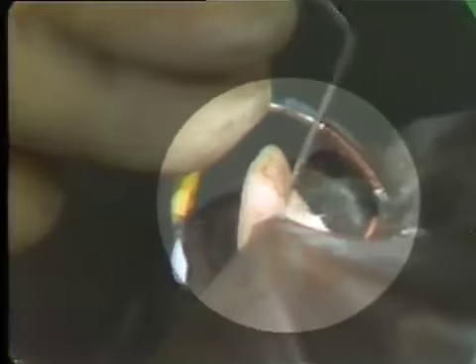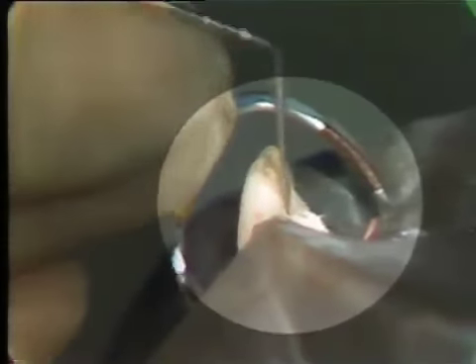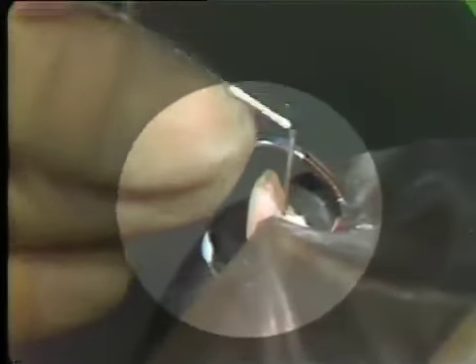Come around. Feel smooth in all directions. I can feel fairly confident that I have removed the entire roof of the pulp chamber.